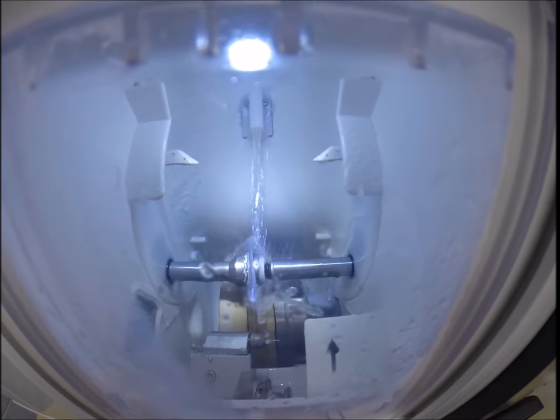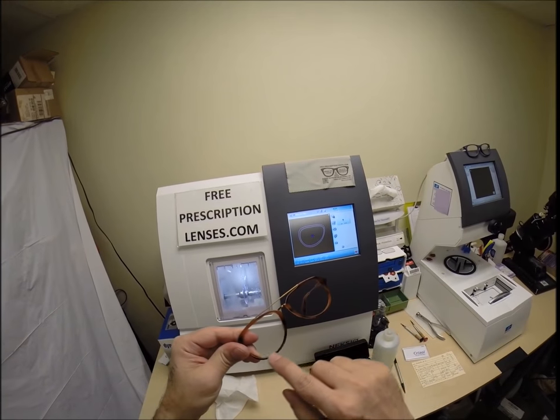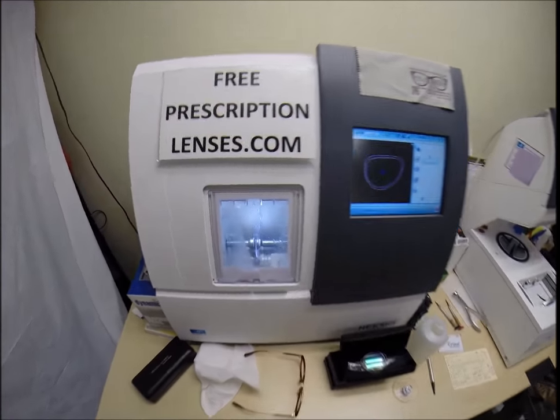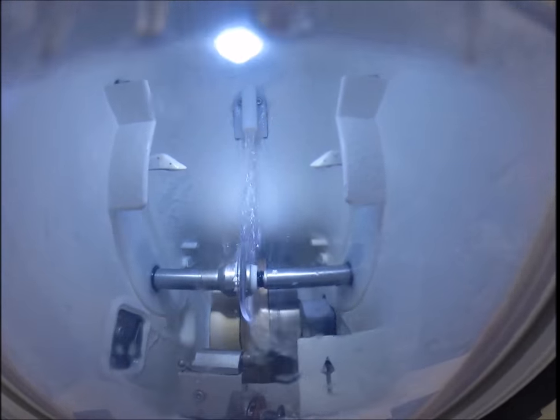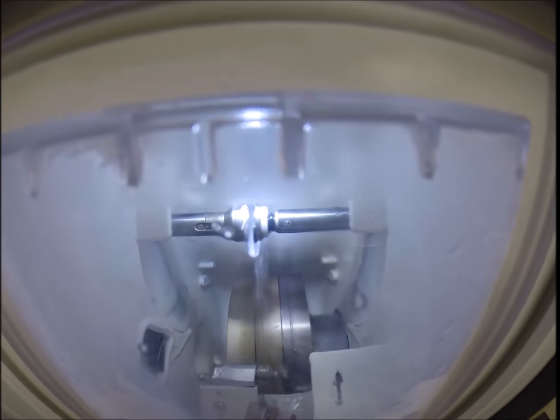If I were to force the lens in there, it would cause your frame to stretch or roll. A lot of people will use heat to make your plastic pliable before inserting the lens. But once that cools off, it's going to distort your frame, stretch the frame out, possibly cause it to crack or break later on. Anyone who's ever had a frame break going around, that is why the lens was cut too large.